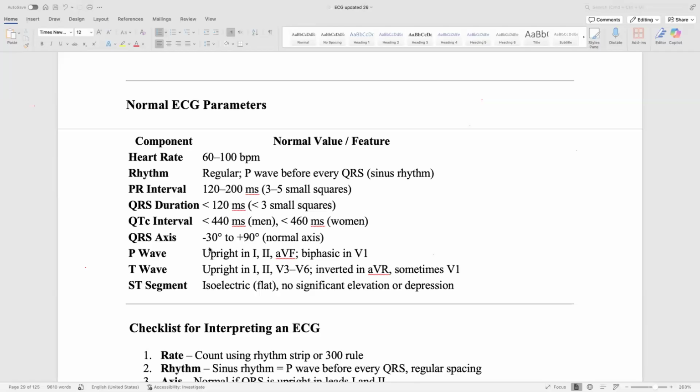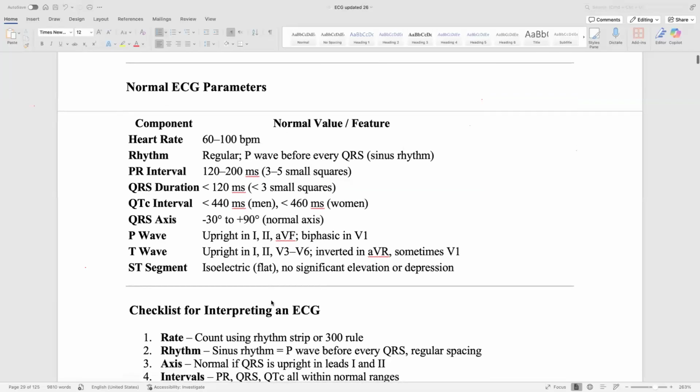Okay. The QT interval is measuring the repolarization, because it is measuring the T wave. The T wave is repolarization, in which the heart muscle regains the negative charge inside. It measures the ability of the heart for repolarization. That is why it reflects the electrolytes working in repolarization, especially calcium and potassium. All right.